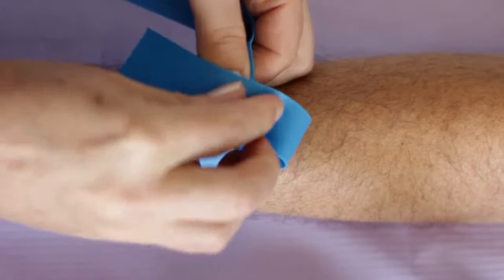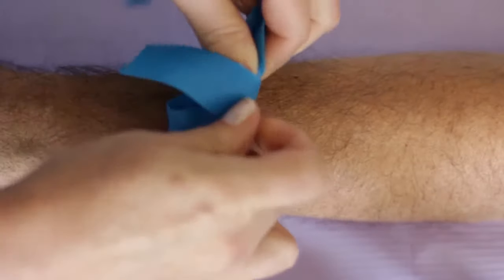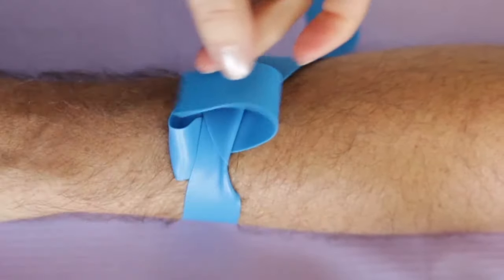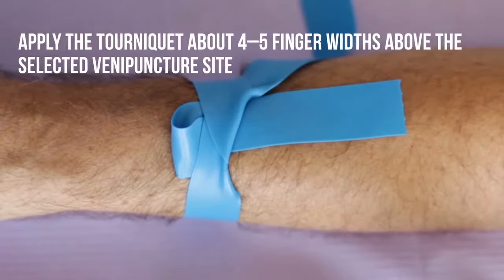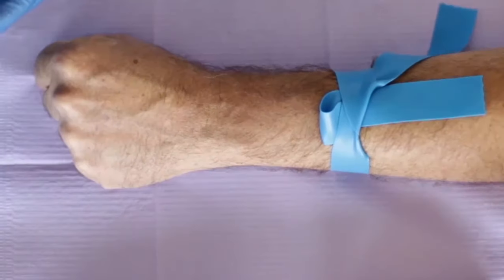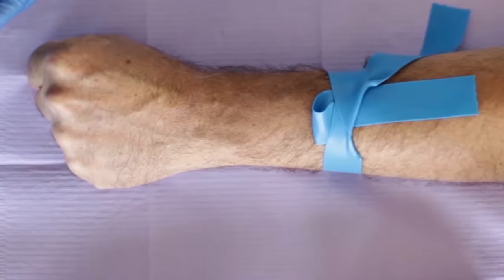When ready to draw the blood, apply the tourniquet about 4 to 5 finger widths above the selected venipuncture site. Ask the patient to form a fist to make the veins more prominent.